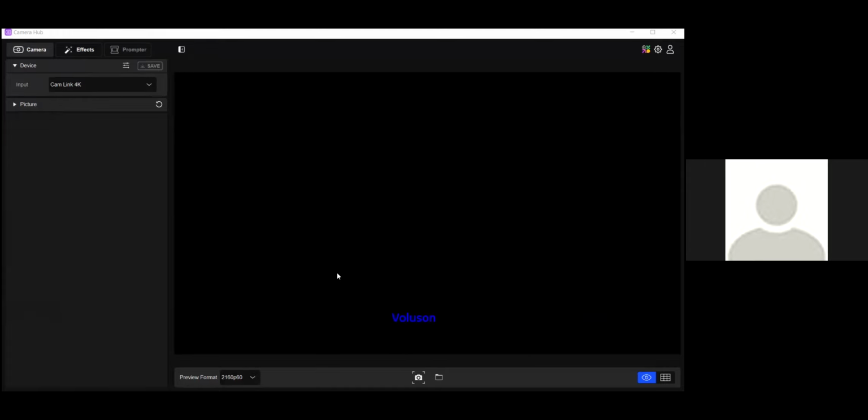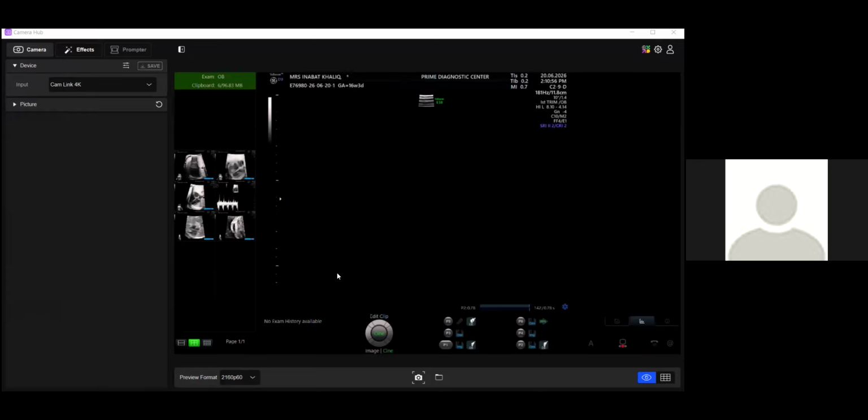Okay, let's check the position in case it is there. Are we on? We have a 16 weeks gestation, and I'm not sure the position is good or not, but we'll attempt that.